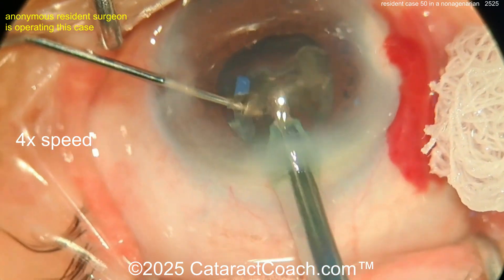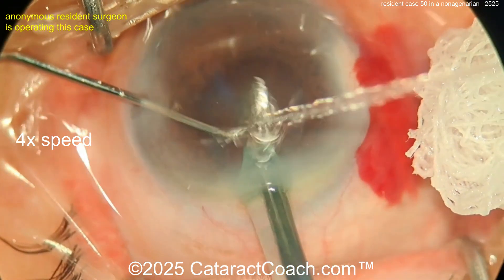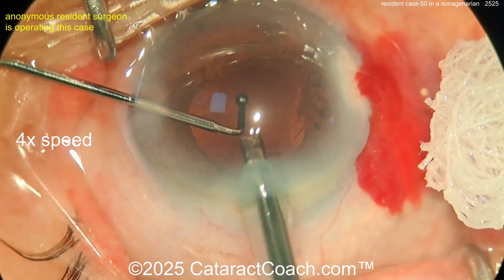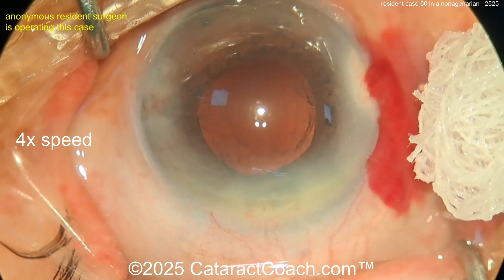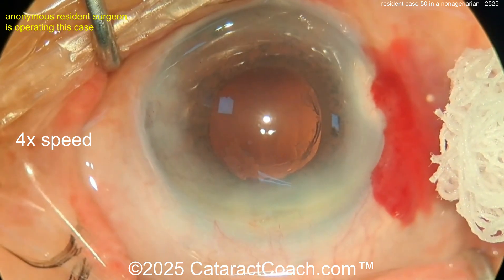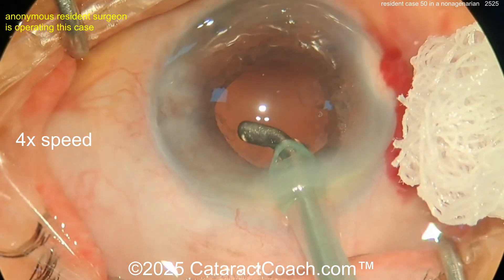Let's aspirate these pieces down — be careful of the capsule coming up. Nice and easy, doing a good job. Remember it's a 30-minute surgery. There's the epinuclear shell coming out nice and easy — beautiful. Let's get that cortex cleaned up. There are lots of little things we can improve on here.